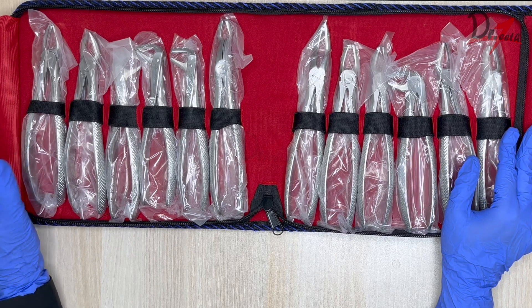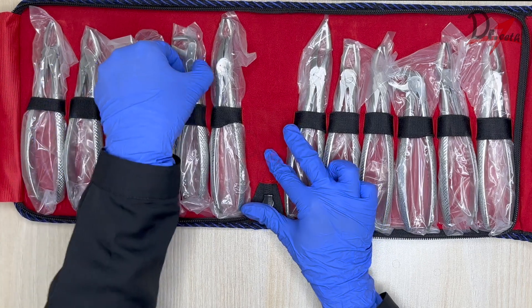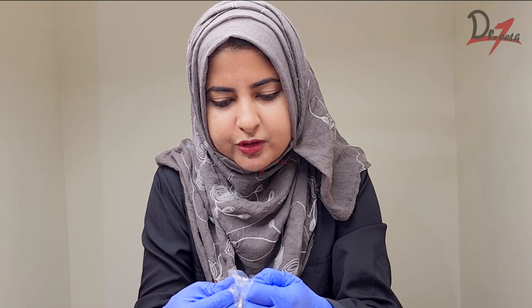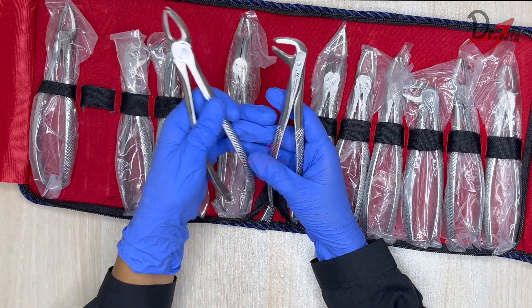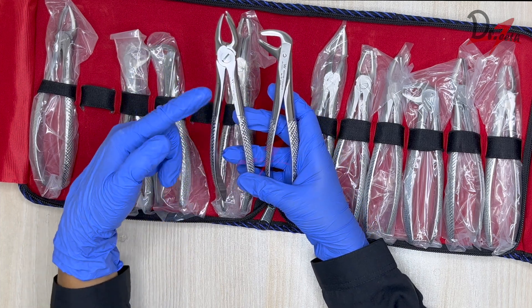First let us understand the basic difference between the maxillary and the mandibular extraction forceps. I'm going to pick up two extraction forceps — one is having a different design than the other. I'm unboxing them in front of the camera for the first time. Here we have the two basic forceps. We'll first look at the parts: we have a beak, a hinge, and a handle — the same for every forcep.